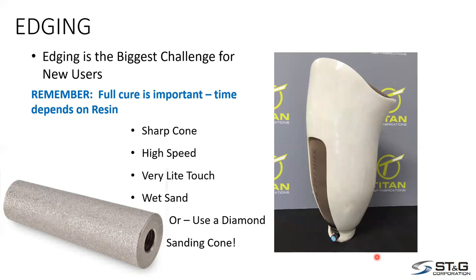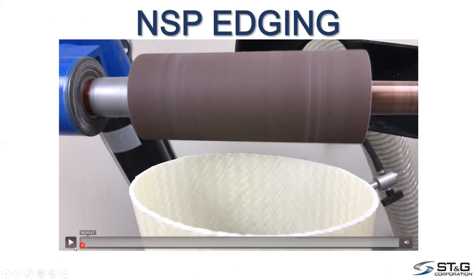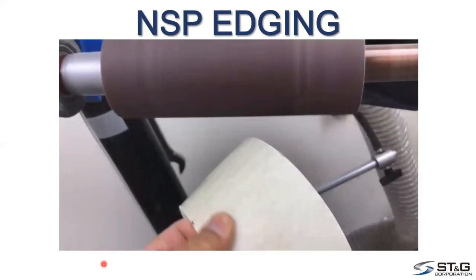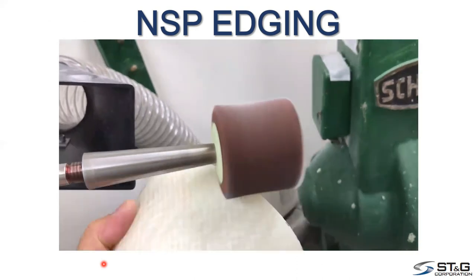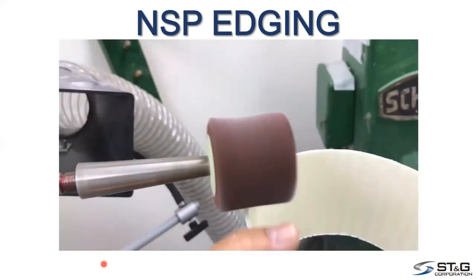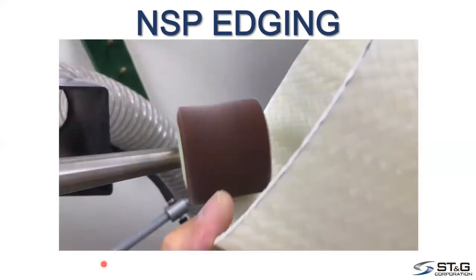So you want to do this from a rough to a finer sanding cone, and then do a wet sand so that you get a nice clean edge. The other thing, and you can't stress it enough, is to use light pressure. So if we look, I am videotaping with one hand and I'm sanding with the other. And then I'm using a flapper wheel. This flapper wheel works really well after you've gone from a rough to a fine cone, and it'll help to finish off the edge and get it much closer to where you want to wet sand.